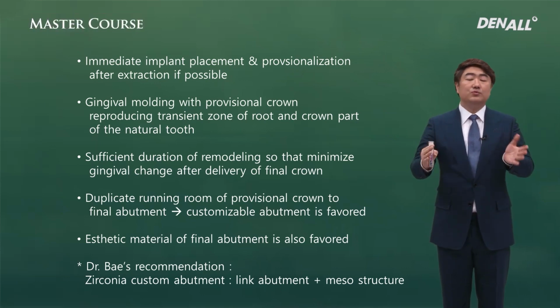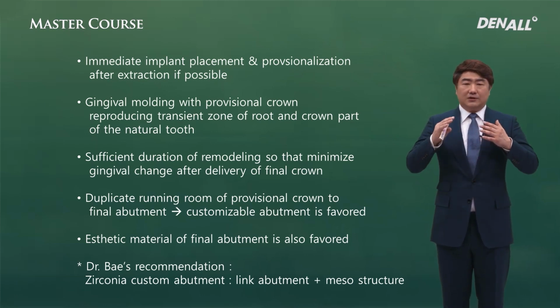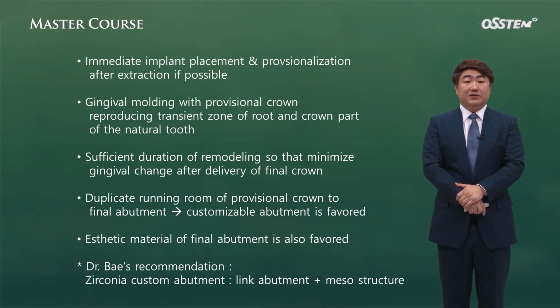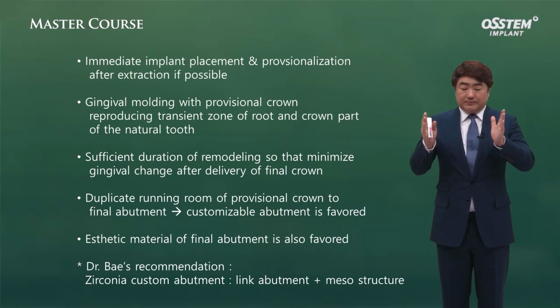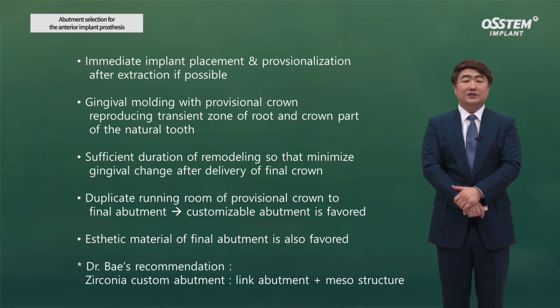Hence, a customized impression coping would be the most ideal choice. But if you use CAD/CAM, then whatever impression or scan you take, the temporary's outer part can be reflected, so any limitation in impression taking becomes less important.